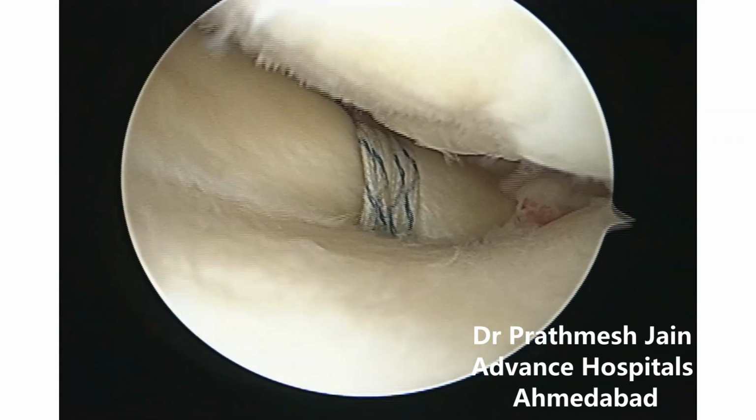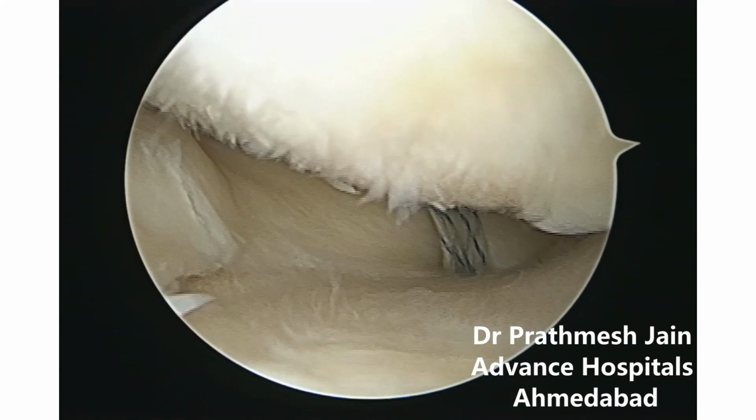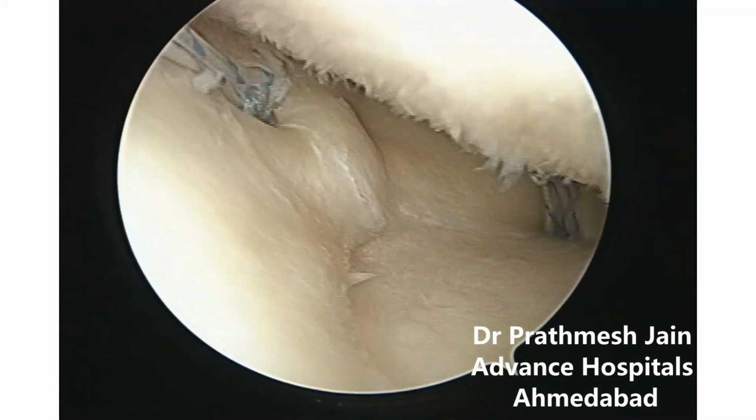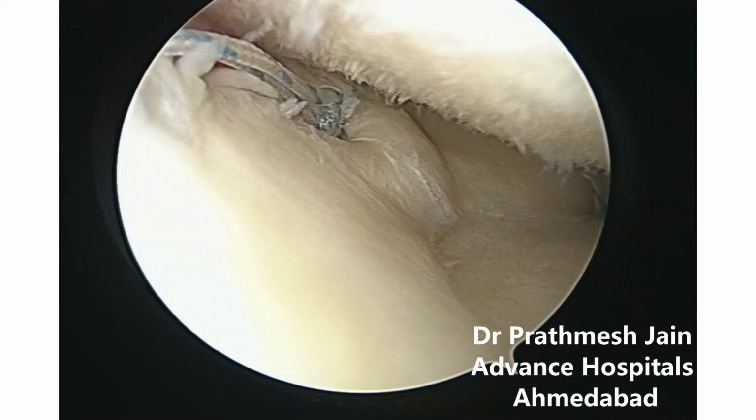You can see this is the final picture, and now the whole of the meniscus is anatomically reduced posteriorly with the root repair sutures, and anteriorly with the meniscus extrusion suture anchor, all-suture fixation anchors.